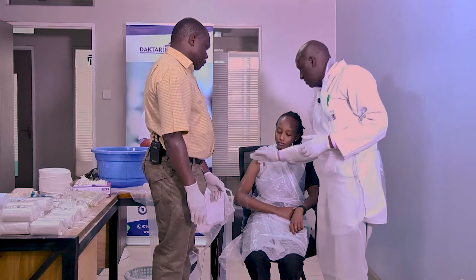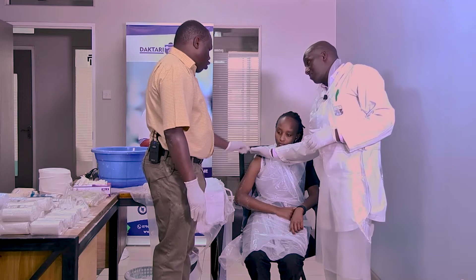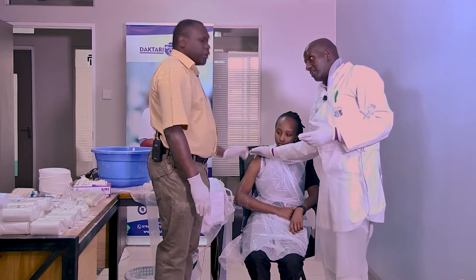That's a very good question. Always, especially for the U-slab, you go just at the acromion — maybe the acromion level. Yes, exactly. That is the level we normally reach.